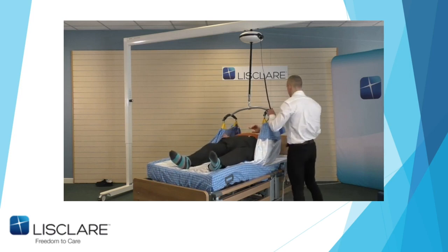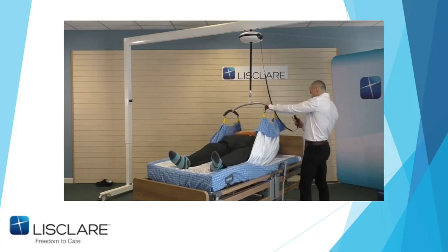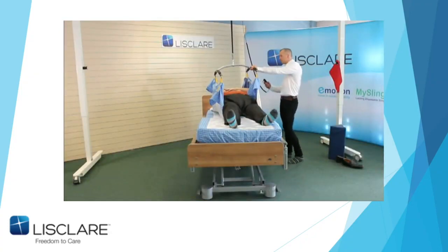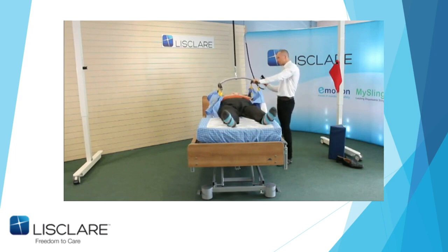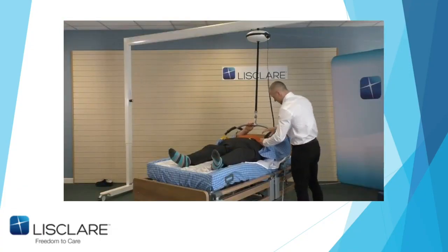Now, John now lets the hoist take the weight. Everything's in correctly, John. And there you go. And back down again. And that is actually put, and John will witness it, I am now about an inch from the top of the bed. Okay. Thank you, John. We take that off.